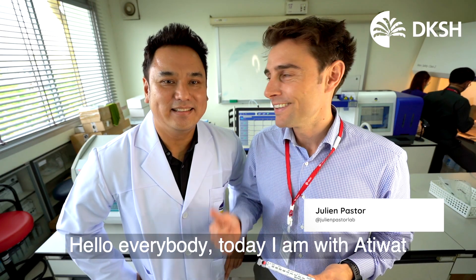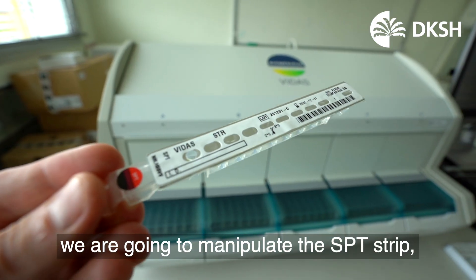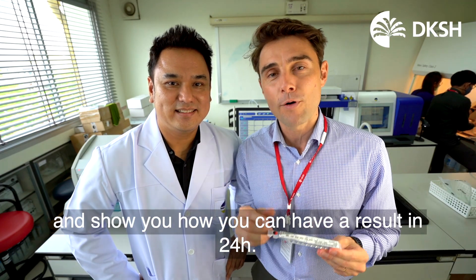Hello everybody, today I am with Atiwatt. We are going to manipulate the SPT strip with the Vidas and show you how you can have a result in 24 hours. Let's go.